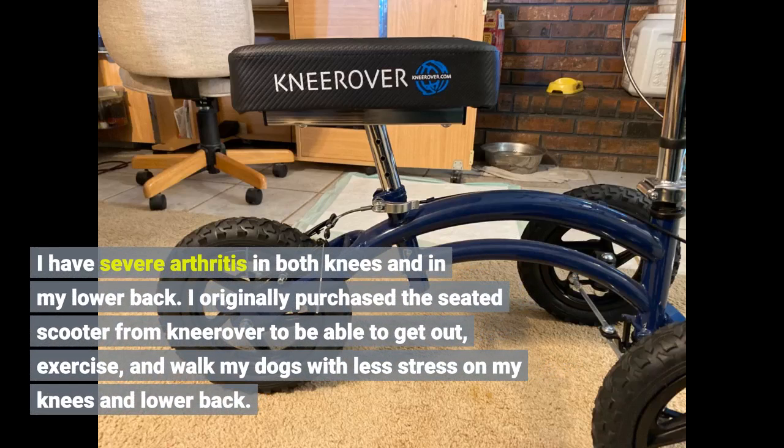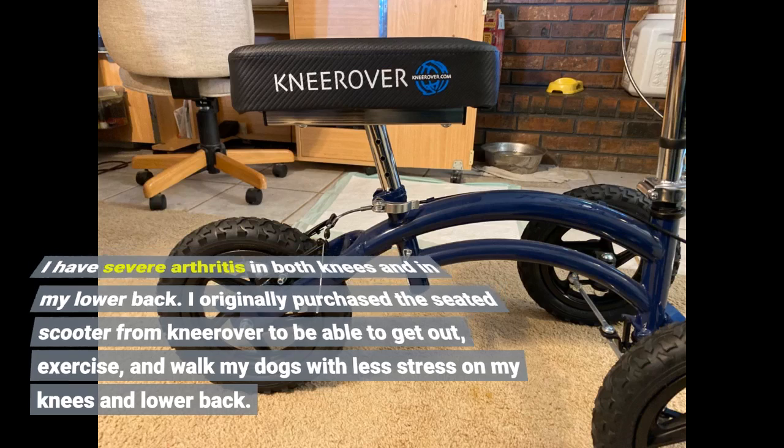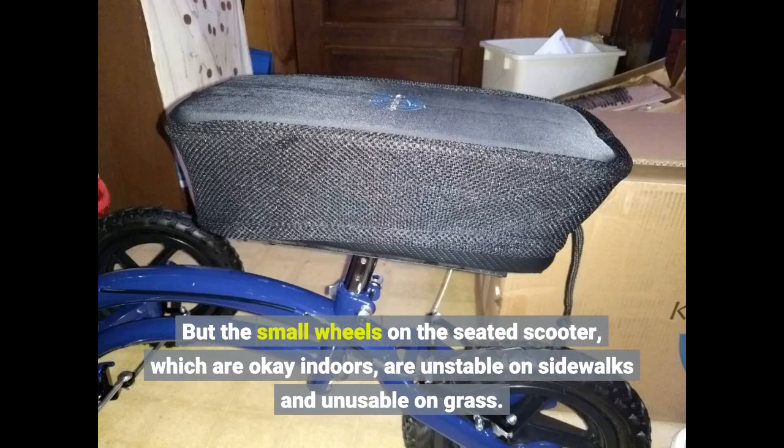I have severe arthritis in both knees and in my lower back. I originally purchased the seated scooter from KneeRover to be able to get out, exercise, and walk my dogs with less stress on my knees and lower back. But the small wheels on the seated scooter, which are okay indoors, are unstable on sidewalks and unusable on grass.